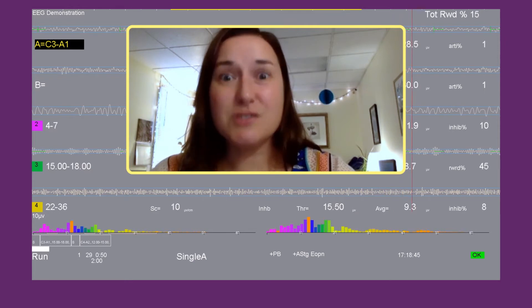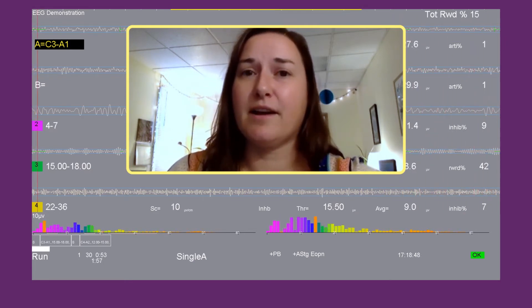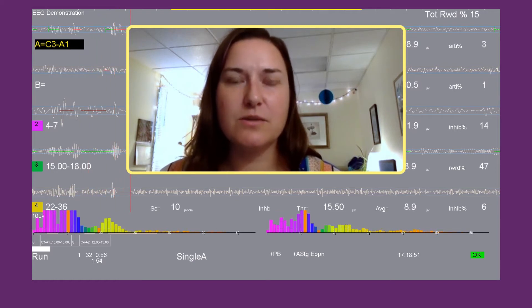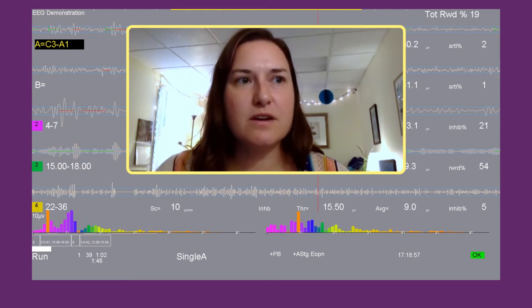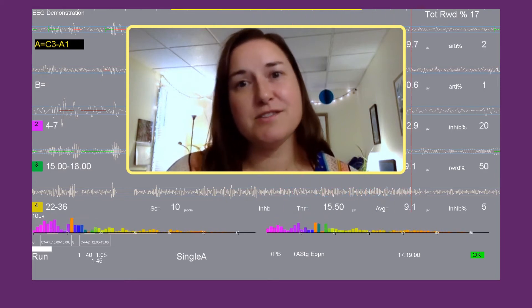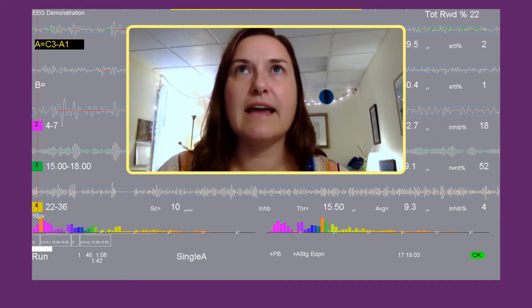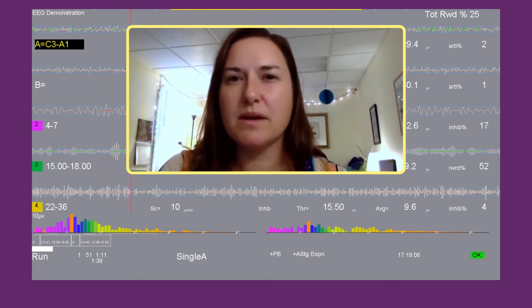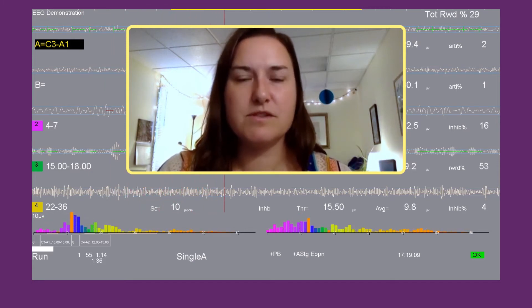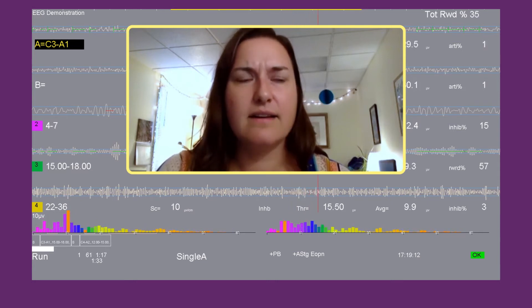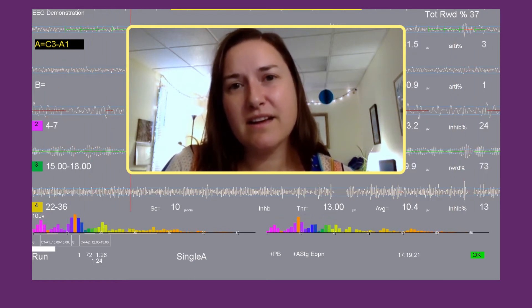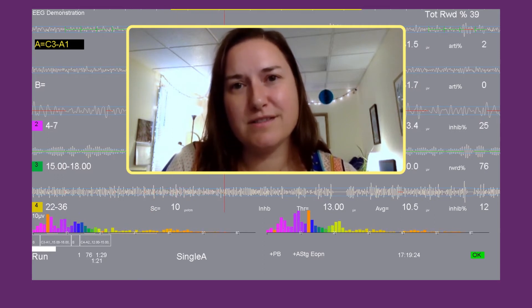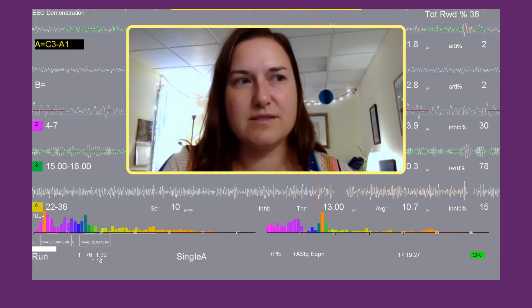This is extremely helpful information when you're working on setting up protocols. You can adjust your settings — either inhibits or rewards — to include the weakest or the strongest. Say the loudest frequency that keeps popping up consistently is four hertz; this person is making an awful lot of that. But it's the middle of the day and they're awake and supposed to be concentrating on something. So I want to make sure that my inhibit is going to include that four hertz to help quiet that down as the person is training.